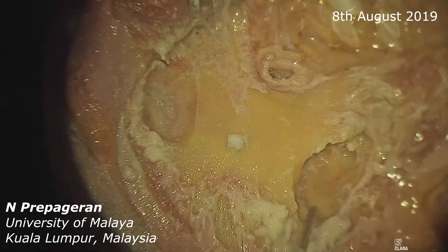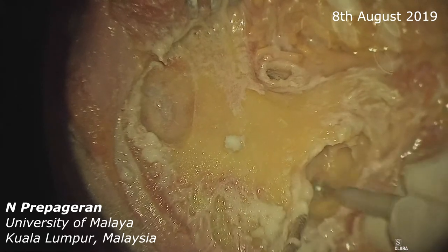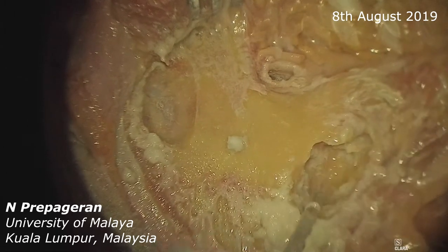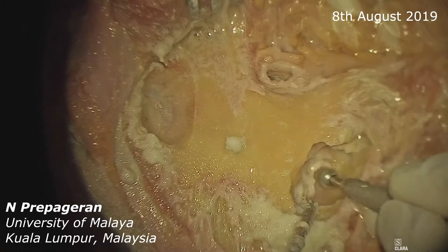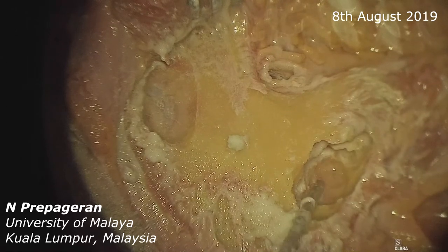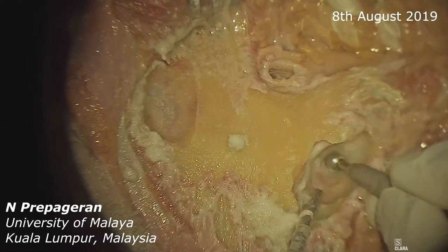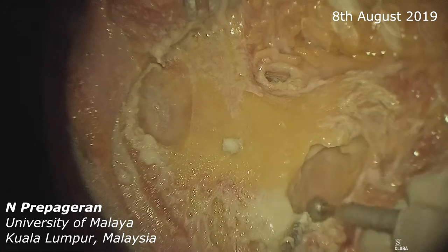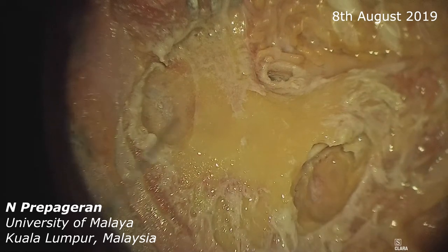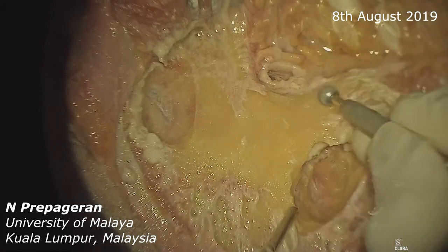This is where the dura of the retrosigmoid would be. So once we have identified the dura of the middle cranial fossa, then the dura of the retrosigmoid, then we can continue our dissection. That's the dura of the retrosigmoid. So once we have found the retrosigmoid dura as well, we identify the dura of all this first — there's middle cranial fossa dura, there's the retrosigmoid dura — now we can remove the mastoid.